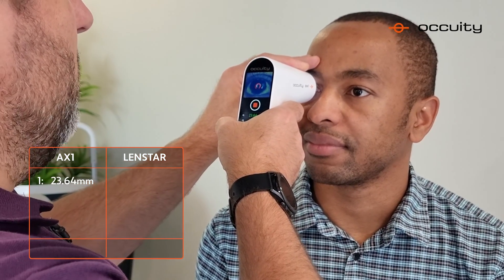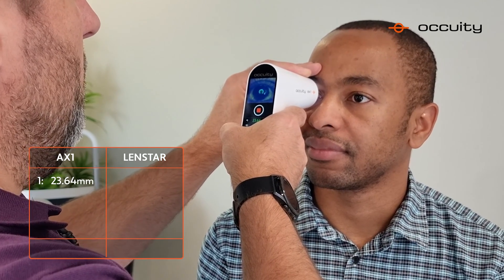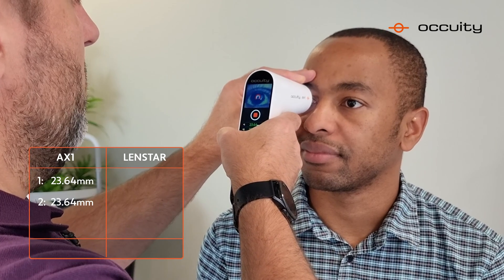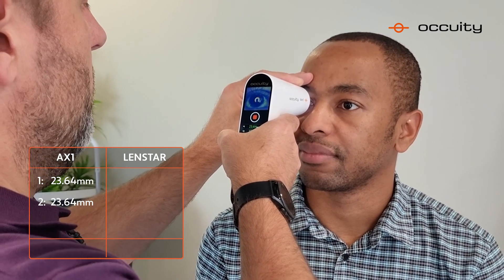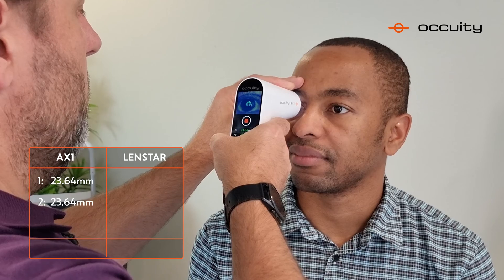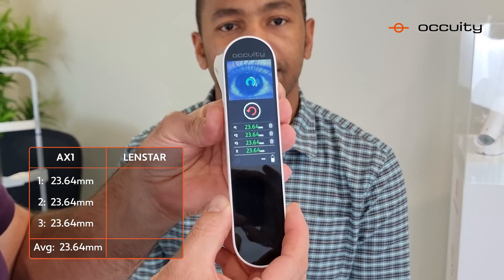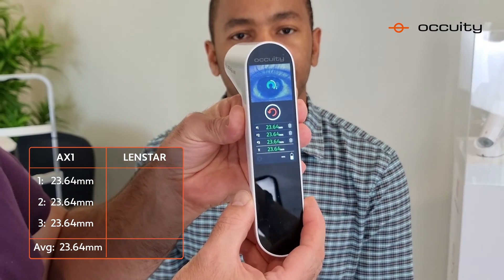You can repeat this process three times. This gives you confidence in the alignment of the measurement. And there you can see a very repeatable measurement of 23.64mm.